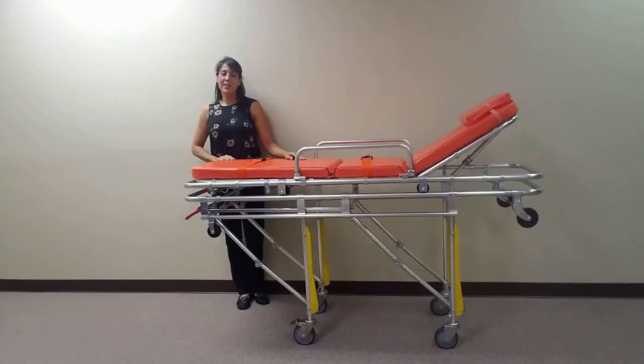MS3C would like to thank you for your continued support. We strive to provide the best in emergency transportation. Be sure to check out the other MS3C models on Facebook and YouTube.